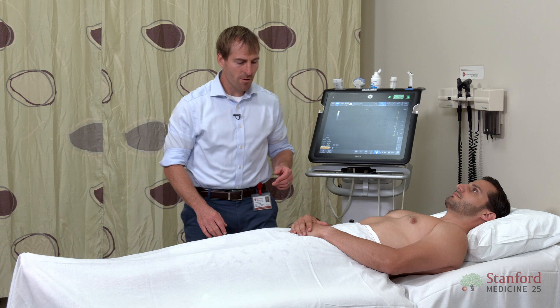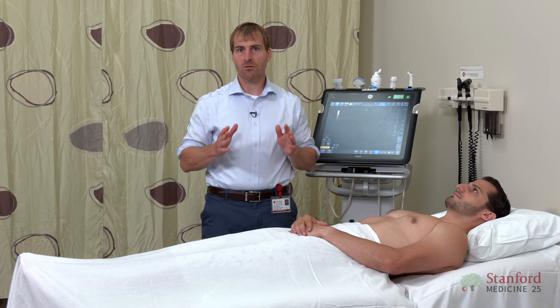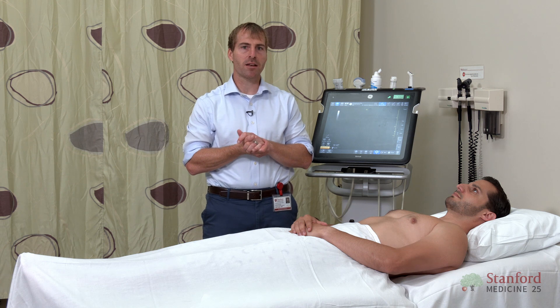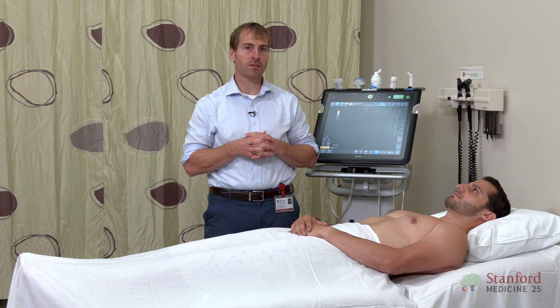Getting started, we first need to define our clinical question. In point-of-care ultrasound, it's really important to ask a narrowly focused clinical question, one that you feel confident you can answer. A really good clinical question might be: for this patient, do they have a left-sided pleural effusion? That's a yes or no kind of answer — it's there or it isn't — and that's something I feel like I can confidently answer.